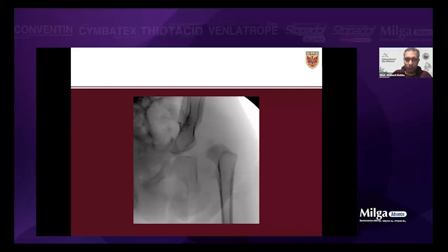Excellent. We have very good questions, but I will just continue to go through the steps, and then we'll determine the redundancy. Dr. Noor mentioned the transverse acetabular ligament. Now I cleaned the hypertrophied ligamentum teres, and before that we cut the iliopsoas tendon, and I removed the pulvinar fat. Use the peanuts, gently look inside.